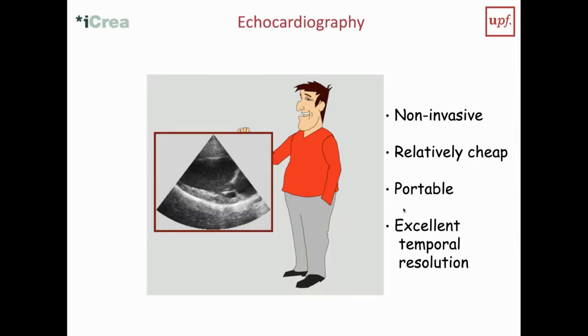Additionally, ultrasound is quite cheap, so because we have a lot of patients, we need a lot of imaging modalities. So we can have tens of ultrasound machines in the hospitals. We cannot have tens of CTs or MRI scanners. Typically, you have maybe 2 or 3 MRI scanners in a hospital, which has then to be used by all disciplines.